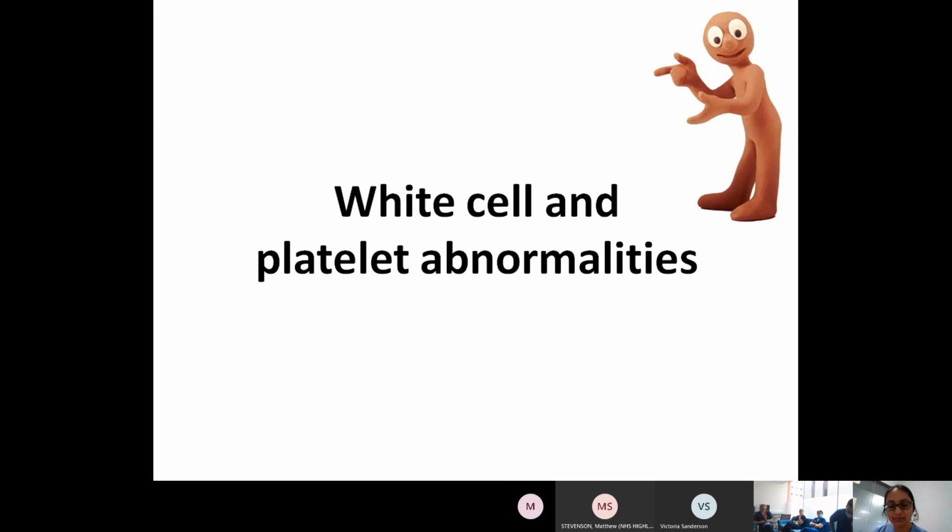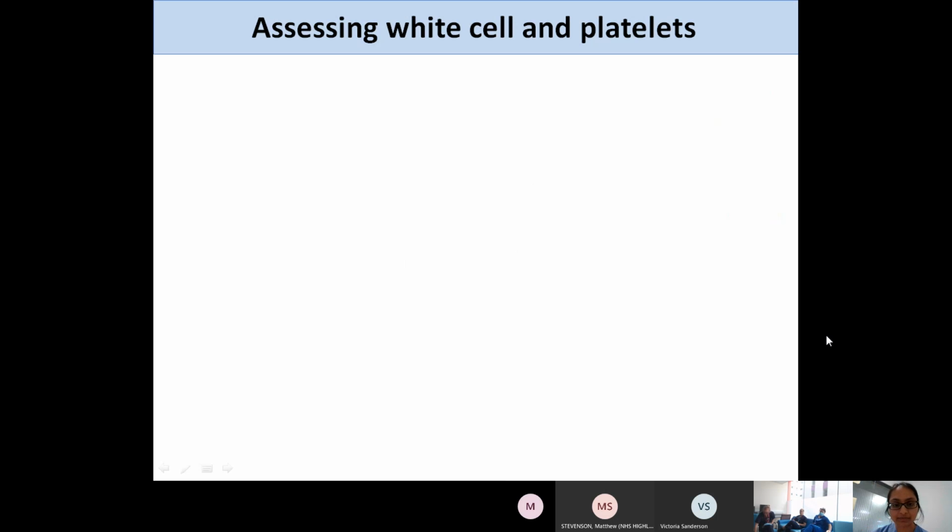So that's all the examples of red cell abnormalities that I wanted to talk about today, and it's just what I had in my collection box. And again, it hopefully gives you a flavor of the kind of red cell abnormalities that we see. So I'll now go on to disorders of white cells and platelets.